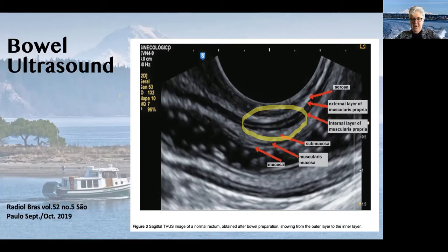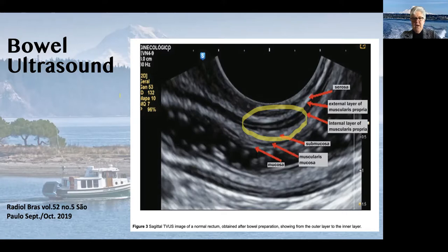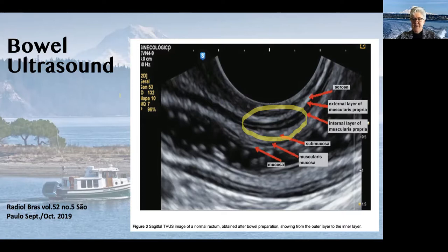I ultrasound pretty much everybody who walks into my office at their first consult. As you can imagine, these people are not prepped, so my pictures are not quite this pretty, but they work. This picture is from a pictorial essay of deeply infiltrating endometriosis which was done by the Brazilians, and I highly recommend that you look at it, especially if you're trying to figure out how to do more of your own ultrasounds.